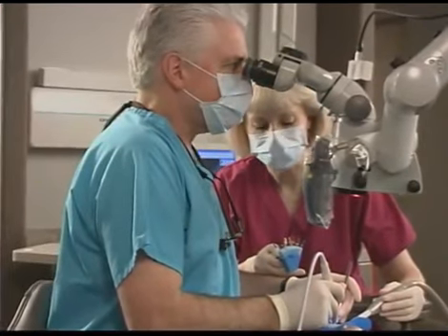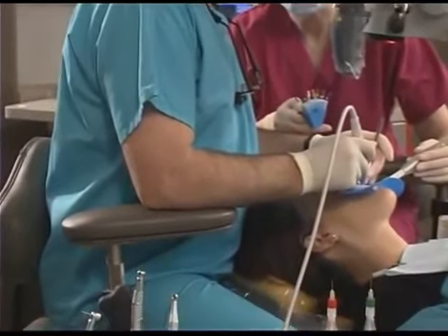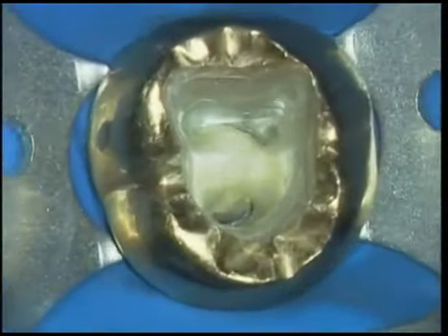Doctor stools with the armrest feature are important because they allow us to have shoulder support and lumbar support so we can be comfortable during our procedures. The pistol grip handles allow us to adjust the light intensity, focus, and the zoom feature.